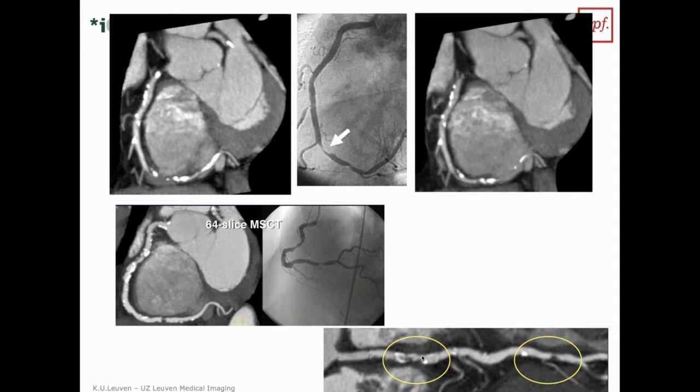So at the disadvantage of having a lower resolution, we have the advantage that we do not need catheterization. And potentially the CT might have a little bit higher dose as compared to diagnostic X-ray, but also we might need less contrast, for example. So it really depends on all of these things. Obviously, in a patient where you almost know for sure that there's a stenosis which is important, based on the symptoms and ECG changes and things like that, then of course you might go immediately to catheterization because you know that you will have to put a stent.